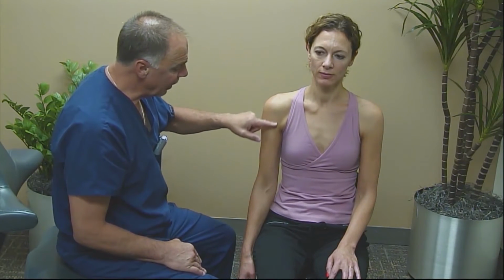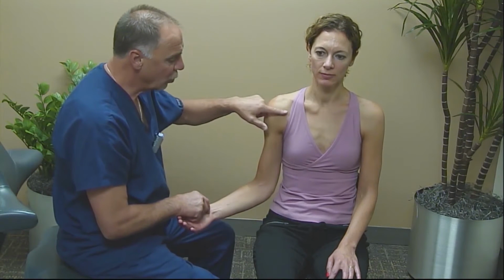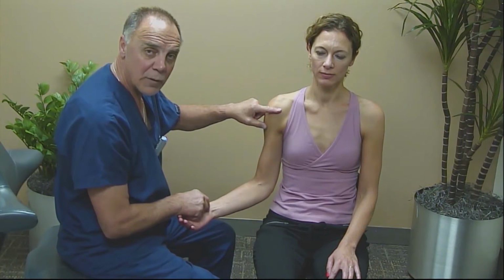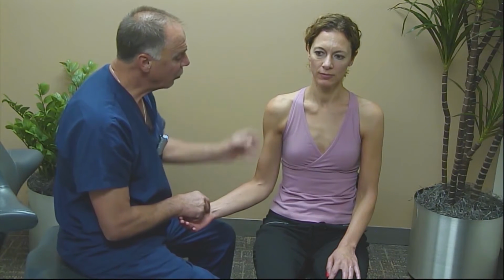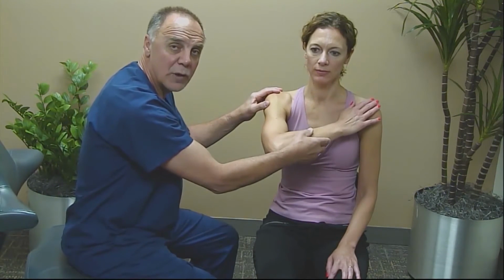Now, just to reiterate what we've done so far, we've looked at the long head of the biceps tendon in long and short axis. We've externally rotated the arm to look at the subscapularis. And we've also done the neutral and cross-thoracic maneuver to look at the AC joint.